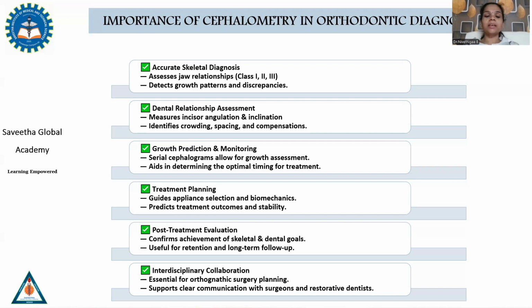Apart from these, which help in diagnosis and treatment planning, it also helps in interdisciplinary collaboration, meaning it helps the surgeons and orthodontists together to plan orthognathic surgical cases, and it helps support clear communication with surgeons and restorative dentists in other cases.